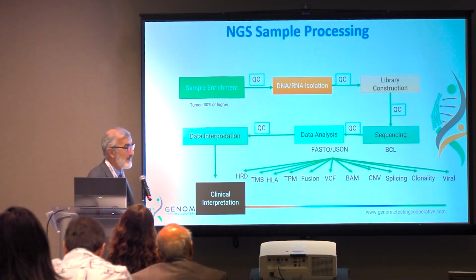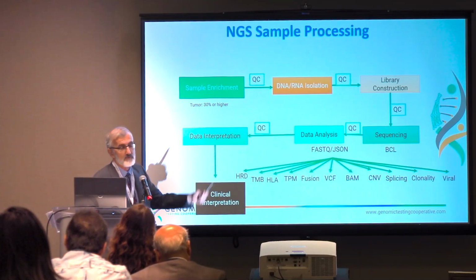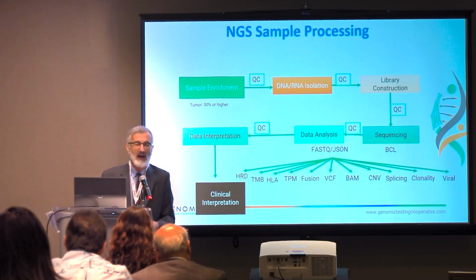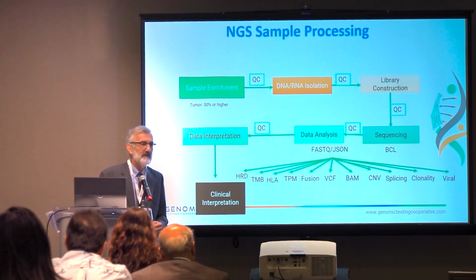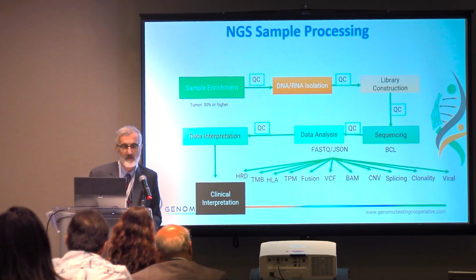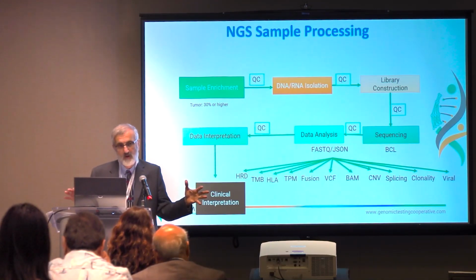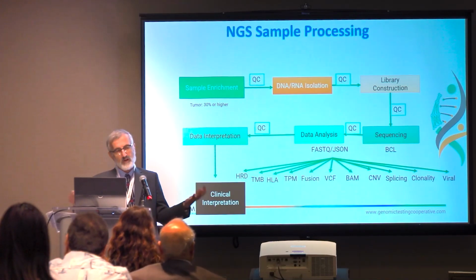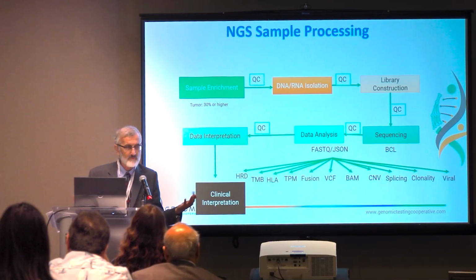Optimally, minimally, we like really to get 30% of our analyzed samples being tumors, and the more tumors, the better off, but 30% is acceptable, and all our assays are validated for the solid tumor, validated on this. But for the hematology, it is, of course, completely different ball games. You have to take what you get.